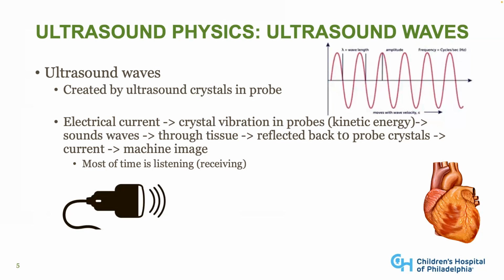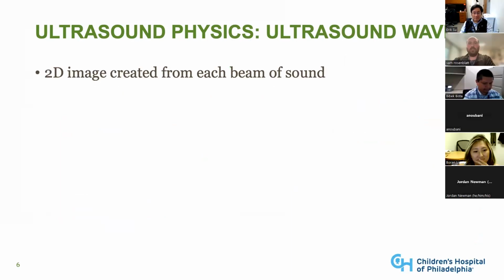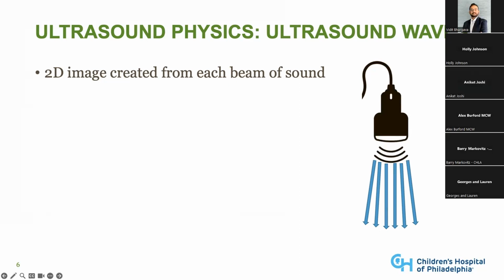I would say that 99% of the time, the probe is just listening. It's just waiting for that sound wave that it created to come back to it from the tissue. Only 1% of the time is it really sending out sound waves. So you can see that lovely animation. That 2D image is created from each beam of sound that is sent out. This is an example of a probe sending out waves across the crystals that are lined up in this probe.